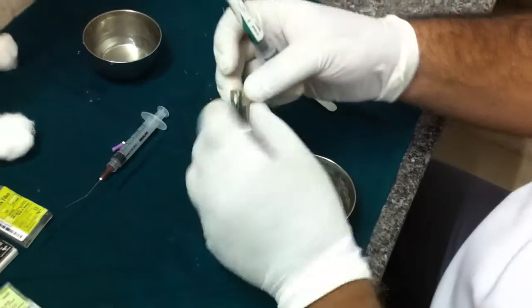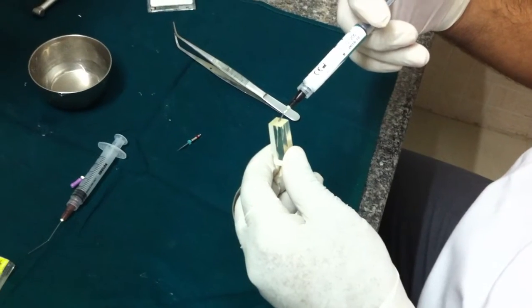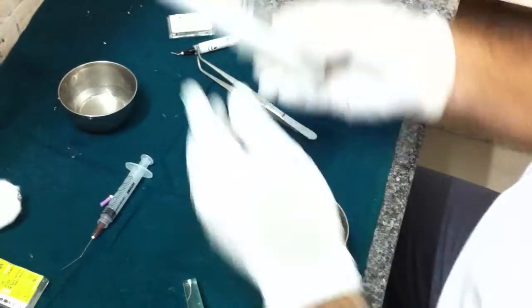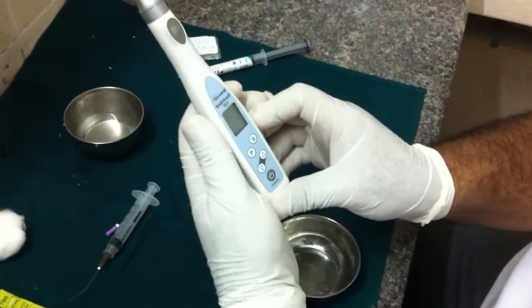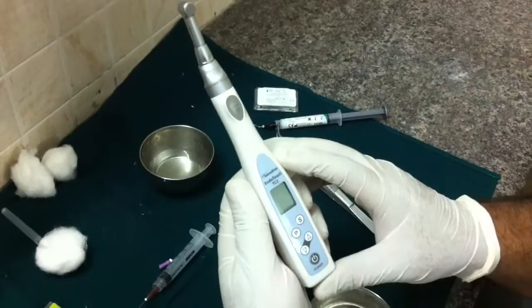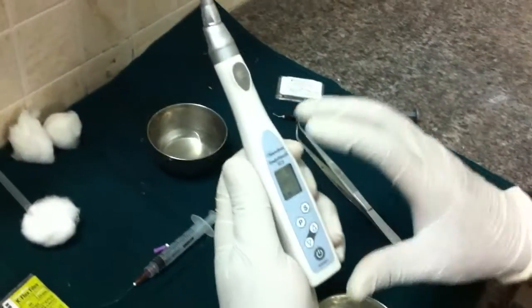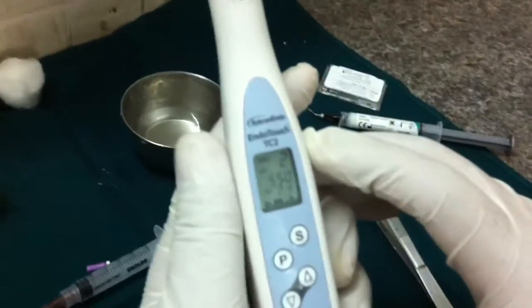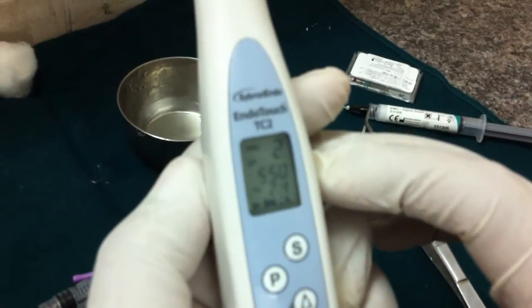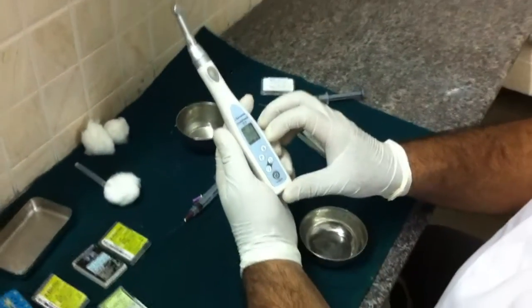Now I introduce EDTA gel. This is Endo Touch TC2 from Sybron again. This is a cordless endo motor, and the speed that I use for K3 is 550 RPM with a torque of 2.4. Anything between 2 and 3 is fine. Generally I prefer to use 2.4.